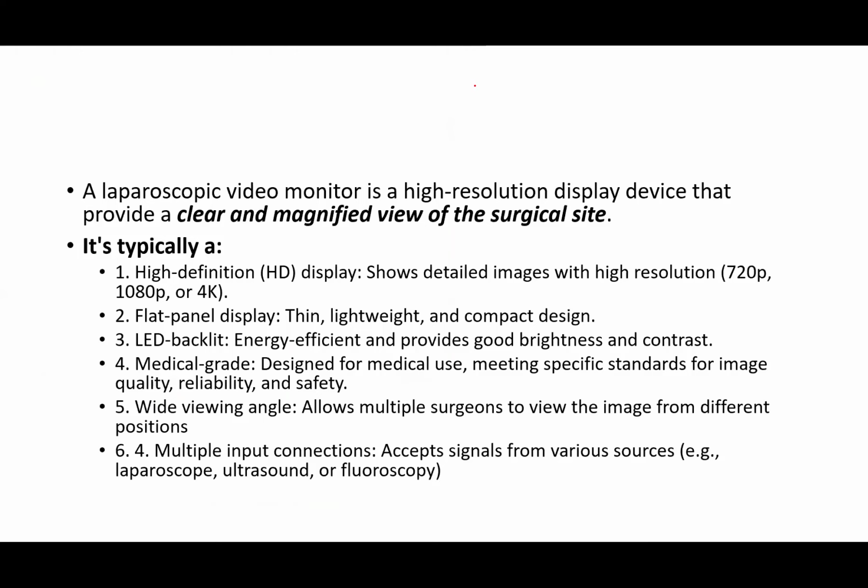A laparoscopic video monitor is a high-resolution display device that provides a clear and magnified view of the surgical site. Okay, now you should know that the image must be clear and it's a magnified view.